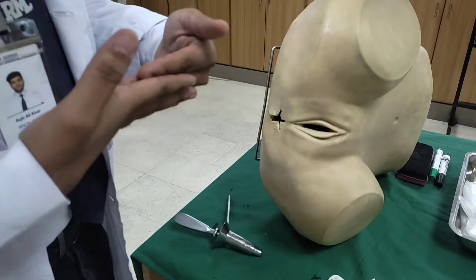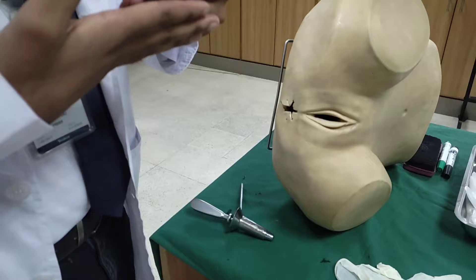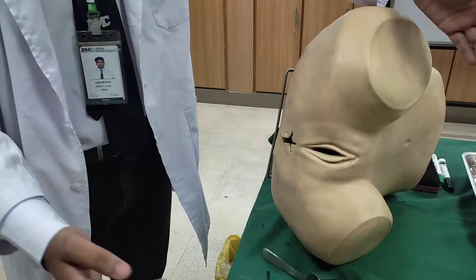For example, I am saying that my name is Dr. Fala. Apart from that, we are going to take consent. Then we are going to take a proper position — we call it the Sims position. The buttocks of the patient have to be towards the edge of the bed. The knee will be bent. The position is proper.